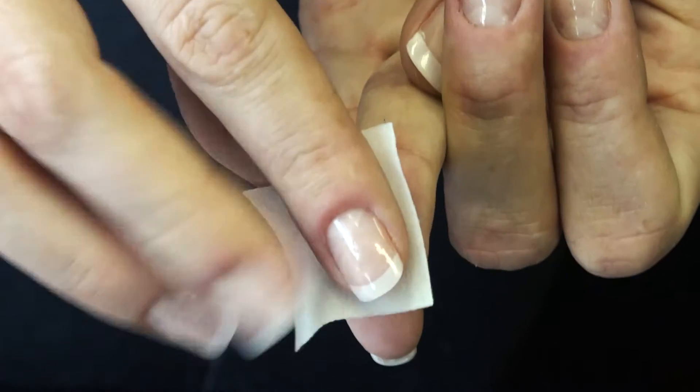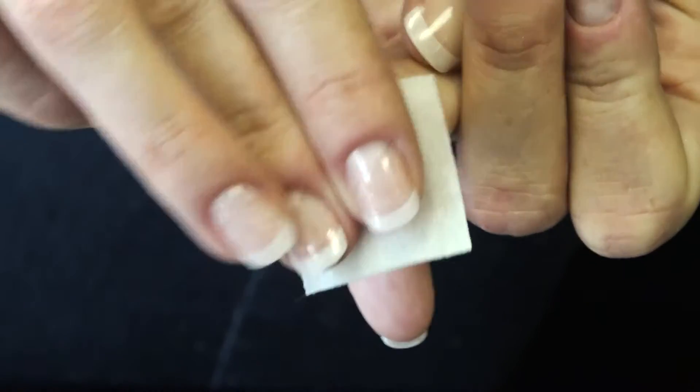Step 3. Slowly massage your fingertip and clean it using the alcohol pad. Wait until the fingertip is dry.